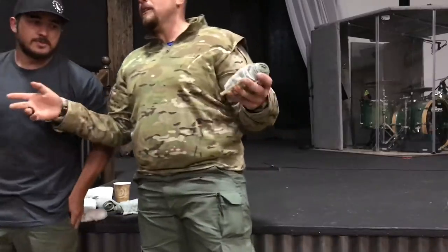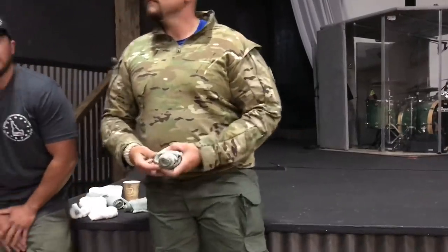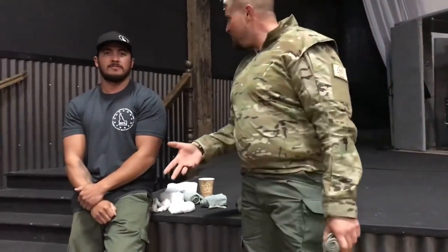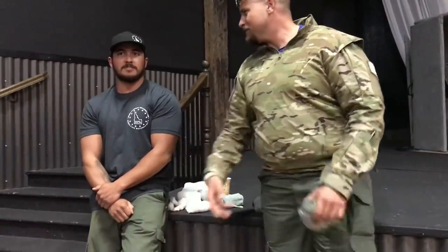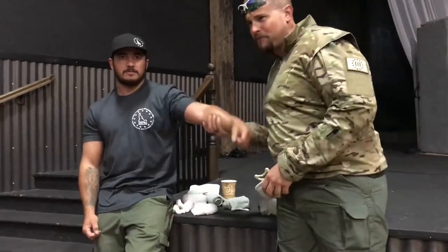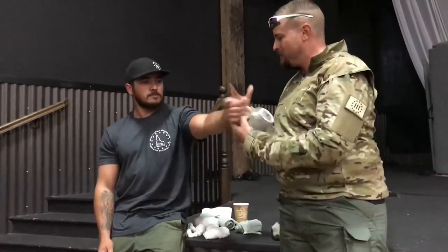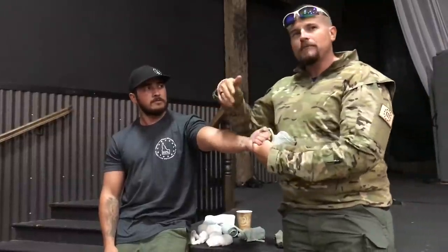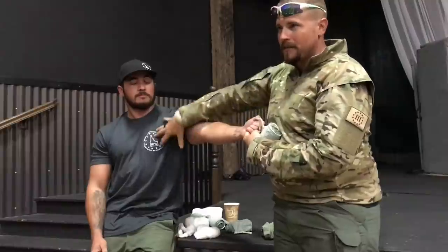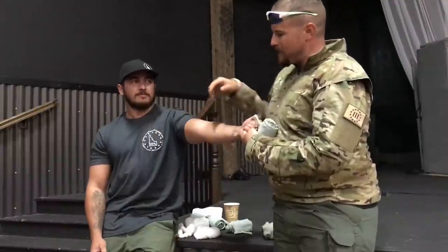Somebody call out an injury to an extremity. Bear trap to the left arm. Bear trap to the left — what were you doing in the bear trap? We've got an injury to the left arm. Bear trap is probably going to be low, so let's look at something right here in the forearm. It's already exposed. A trauma patient is, unfortunately, a naked patient. I'm going to expose the rest of his shirt, look up into his shoulder, and check for other injuries.